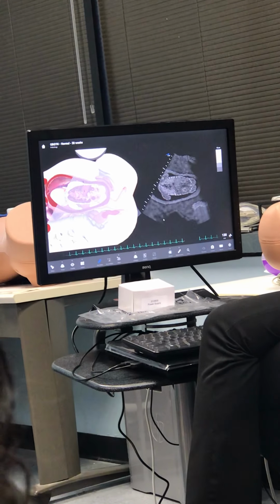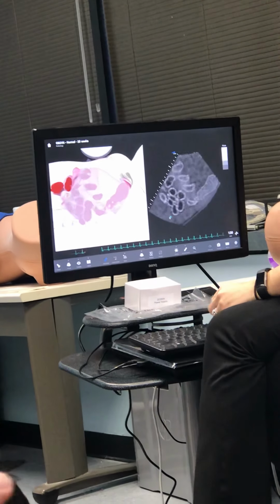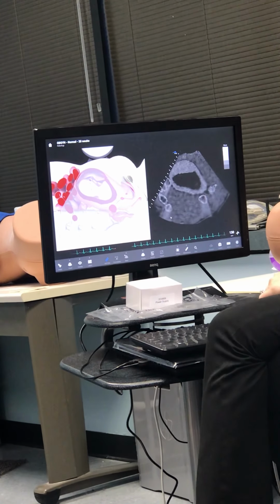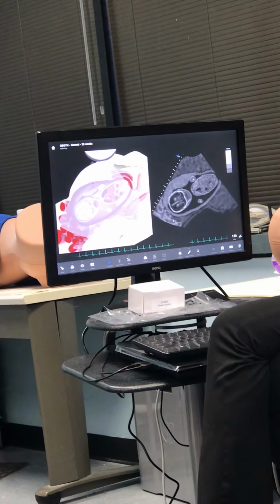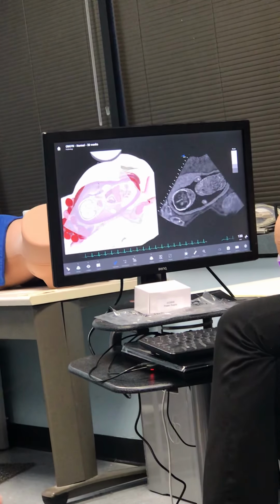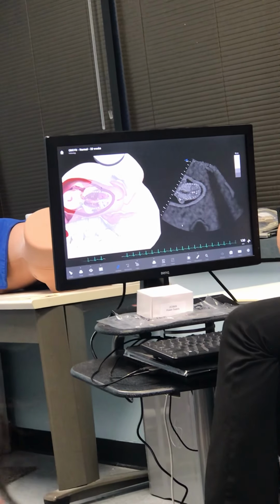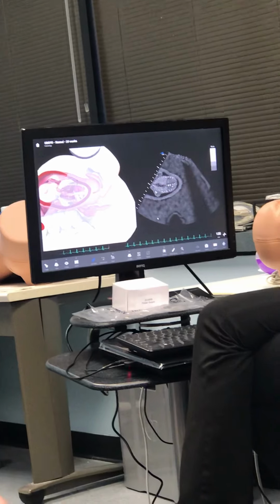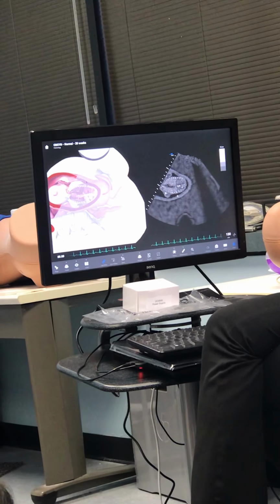Questions? Oh, the other thing that's important about your fluid is that you're staying perpendicular to the table, so like the way that mommy is laying. Because if I go here and I angle up, I can get quite a pocket versus what happens if I stay flat with her. If you stay flat with her, what would you measure there? Just the section underneath the baby, or that back part? I would probably go with whatever is longest. Maybe this one.